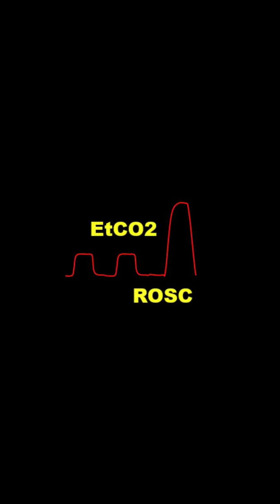Case 2. You're performing CPR. The end-tidal has been around 10 for several minutes, and suddenly it rises to 47. What should you do? Well, finish your 2 minutes of CPR and then assess for a pulse. That sudden rise in end-tidal CO2 strongly suggests that ROSC has been achieved.